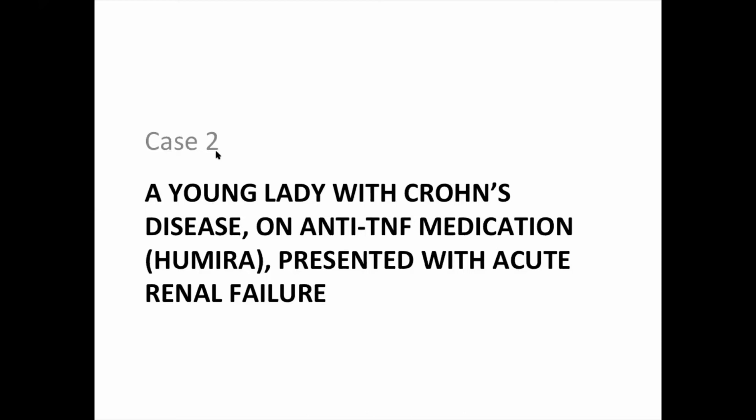So this case is quite unusual, because we had to do lots of levels on the lesion and we suspected something. When we saw the electron microscopy we were like, oh wow, and then we went and read the literature and we found, yeah, there is something in the history that's related to this patient's presentation. Anyway, I think I'm burning the movie.